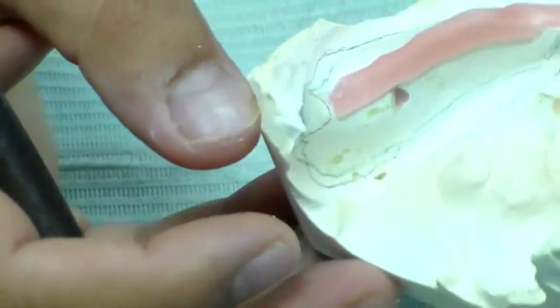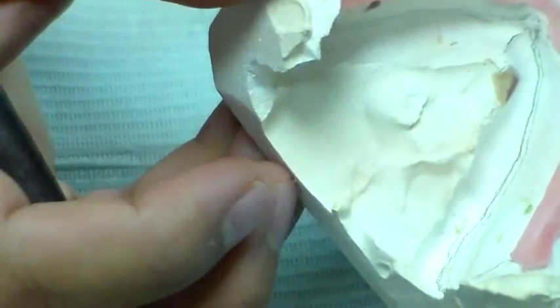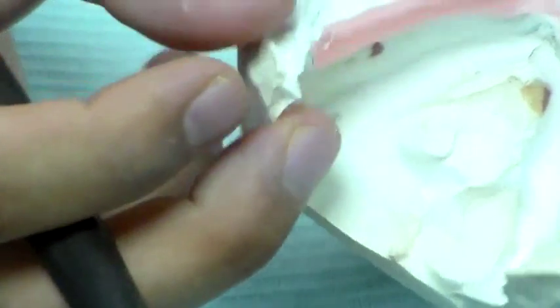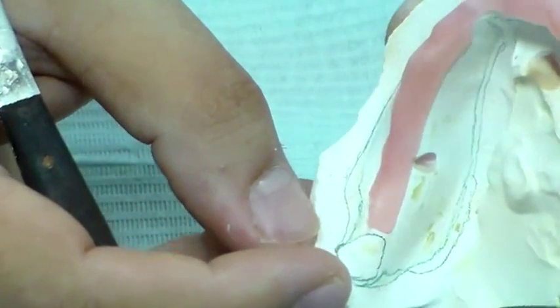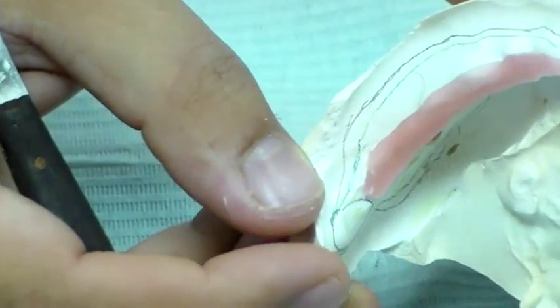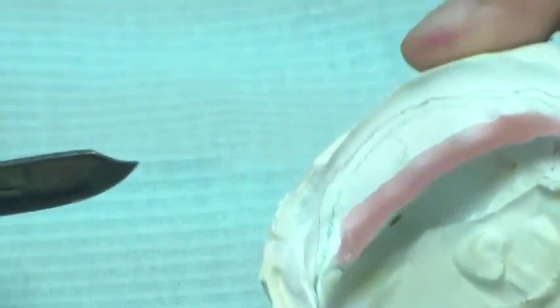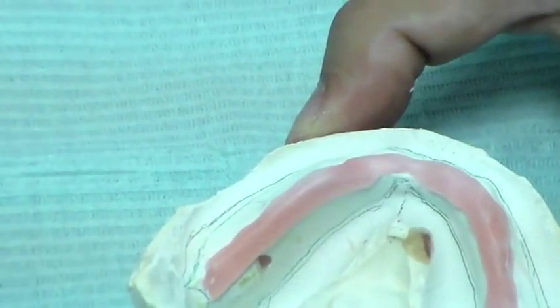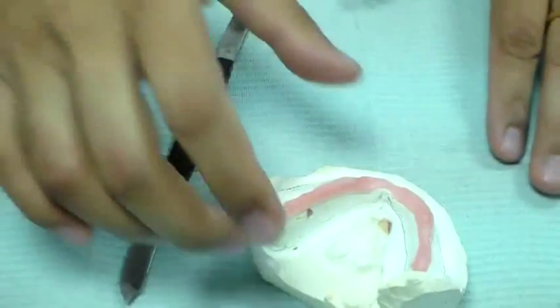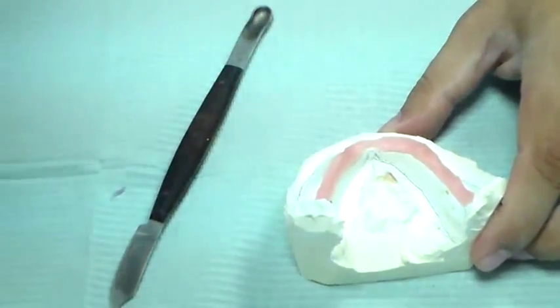You can see the retromolar pad. Here is the retromolar pad on this side as well. You can also see the buccal shelf area, and you can see how it comes over to the anterior here. I have shown you all the landmarks in the areas now.